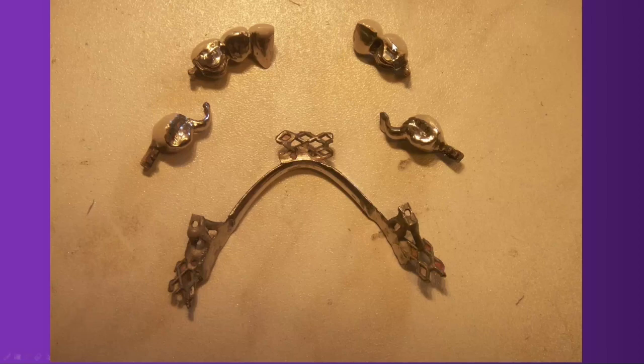And in order to make it absolutely passive, we use that diamond paste. And then we would cement these parts into the conjunctors in order to create everything as one single unit. Yeah, but this is after we place ceramic on the first tooth. This is the image.